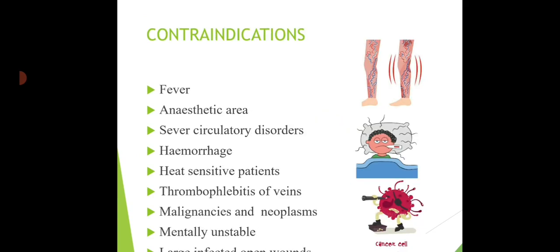Contraindications. A few of the things we have to look for before doing fluidotherapy would be fever or anesthetic area, severe circulatory disorders, hemorrhage, heat sensitive patients, and also mentally unstable patients.